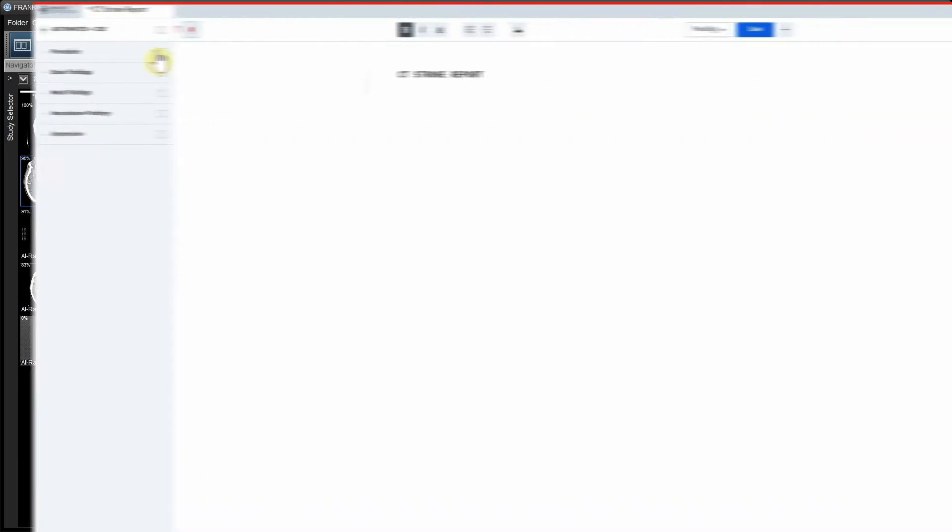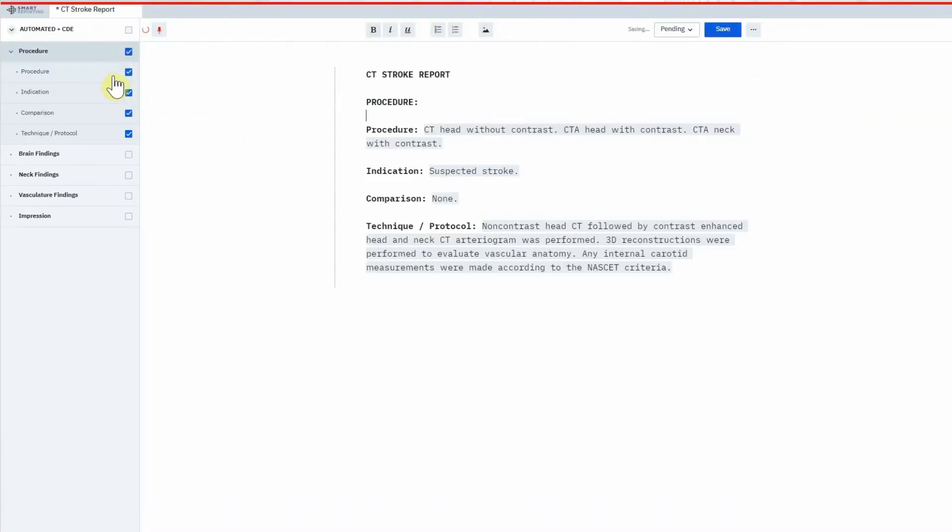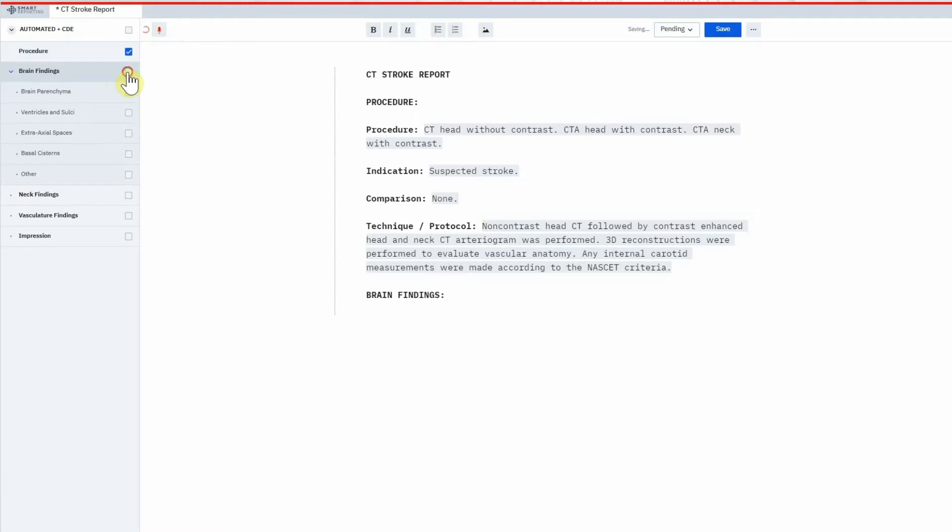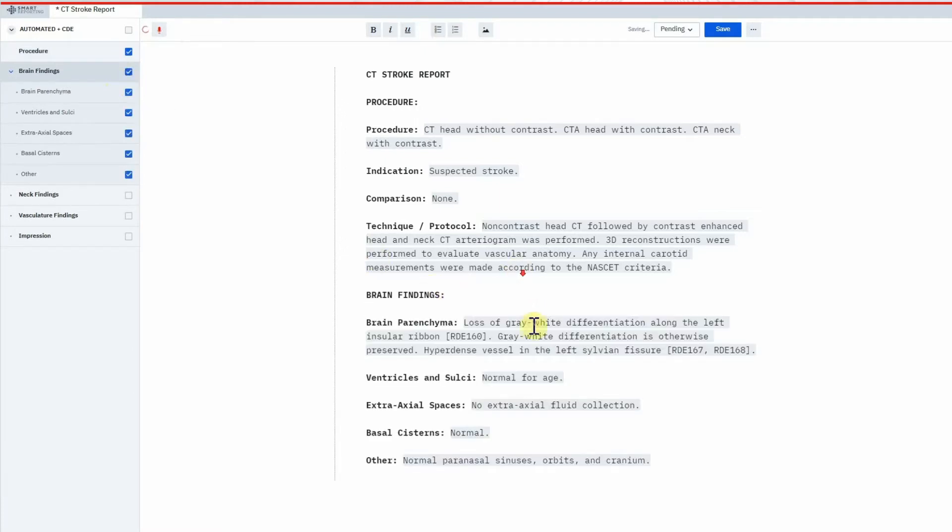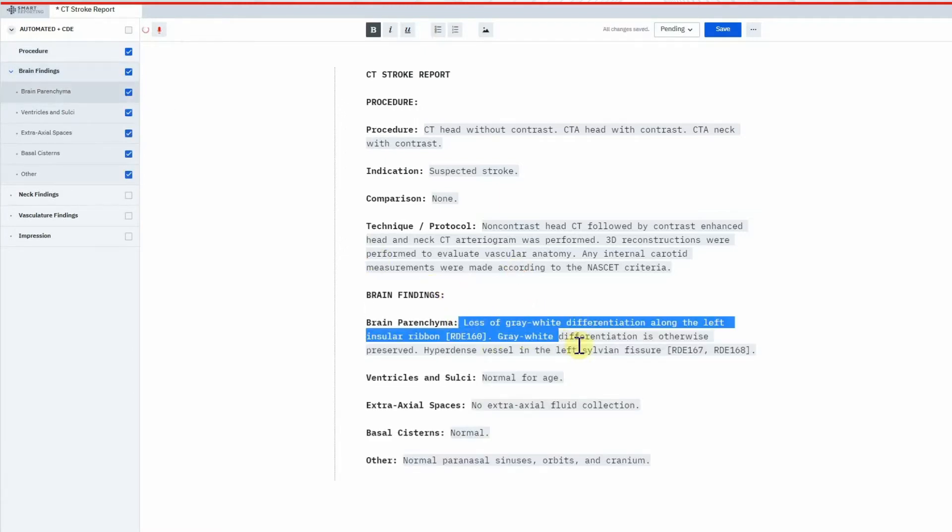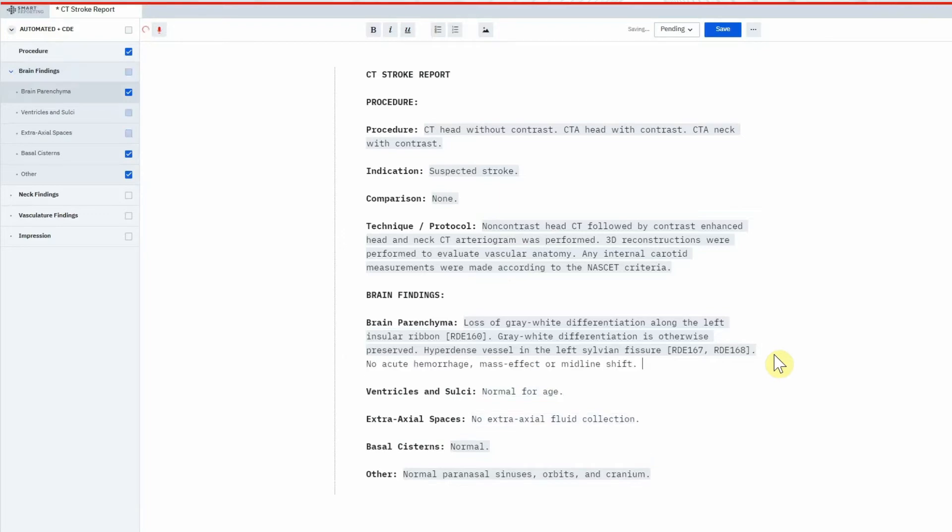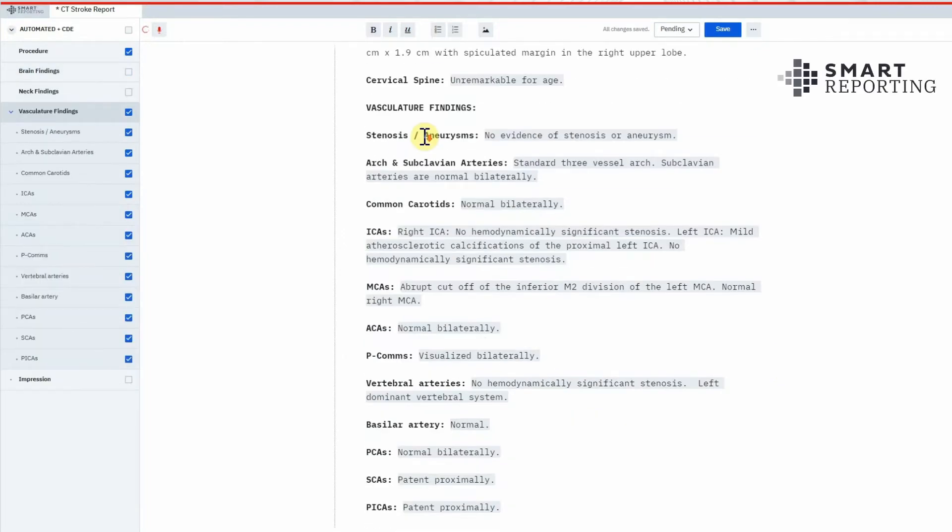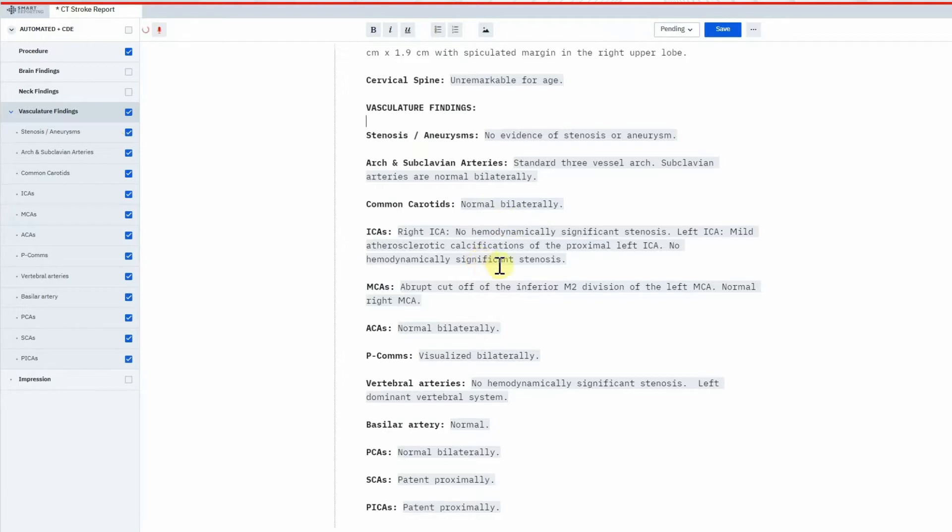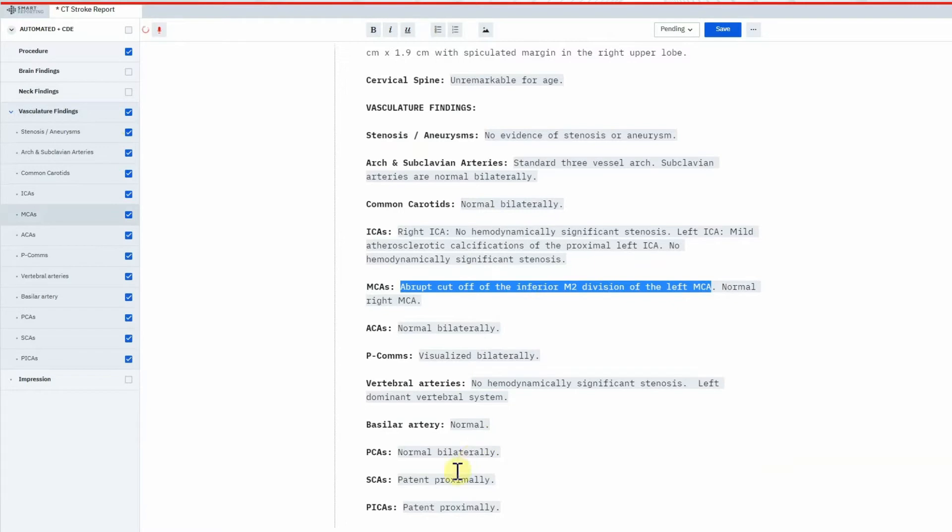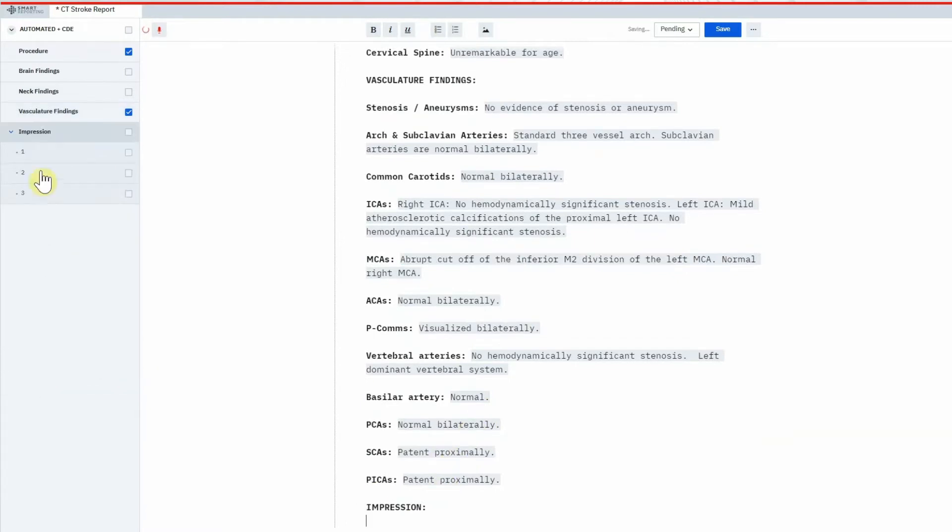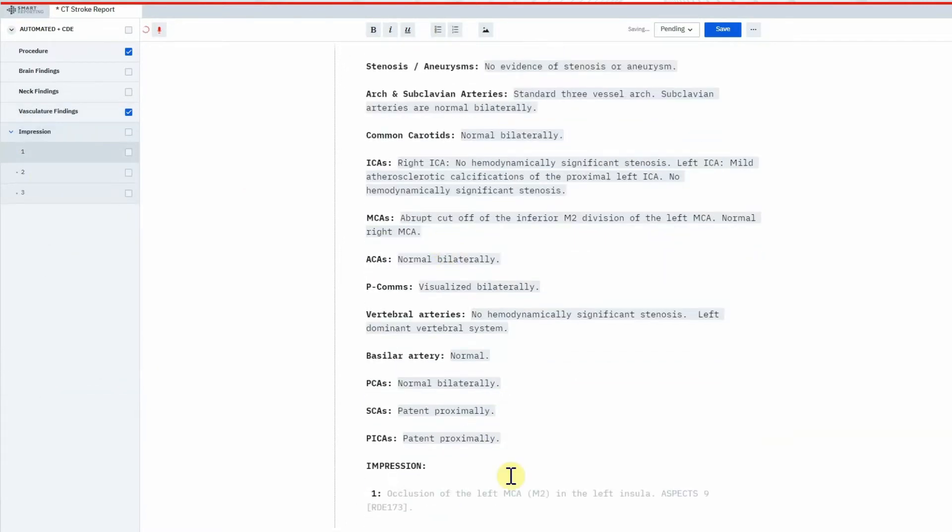As the radiologist begins to dictate the report into the SMART reporting system, they realize that the relevant data has already been entered into the appropriate section of the CT head and CTA head and neck report. The radiologist has the option to either accept or reject the AI results on the GE PACS. For instance, although the ASPECT score of 6 is determined by the AI algorithm, the radiologist edits this to the ASPECT score of 9 that they calculated themselves.